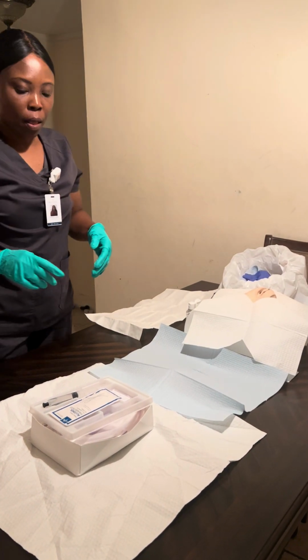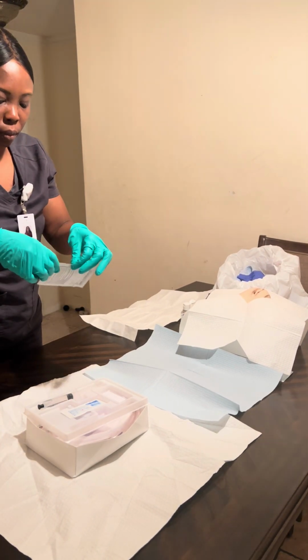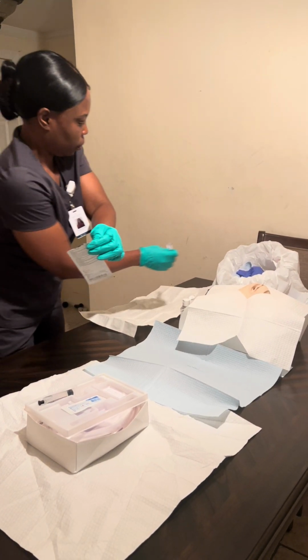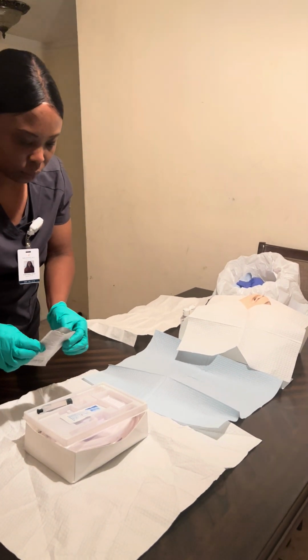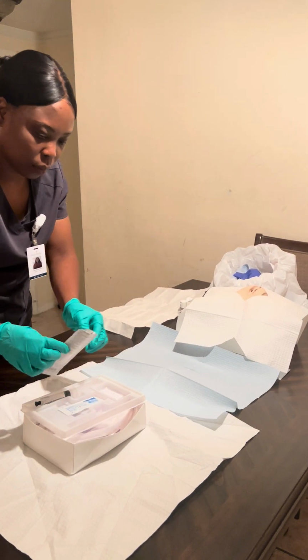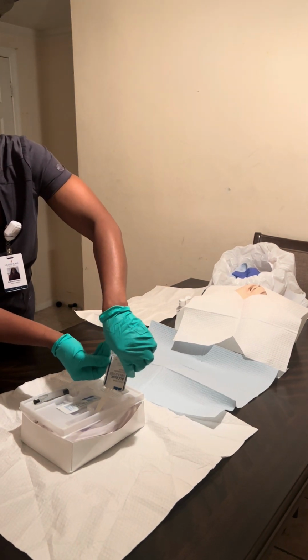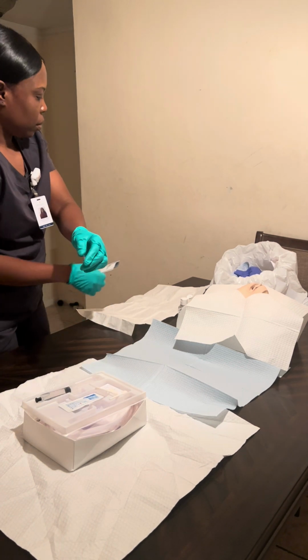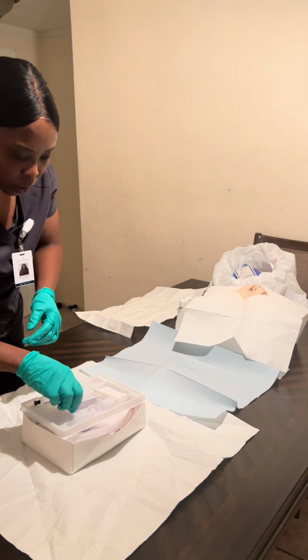Okay, Mrs. Smith. Now I'm gonna pull up my alcohol pad. I'm gonna open it. I'm gonna open my lubricant.